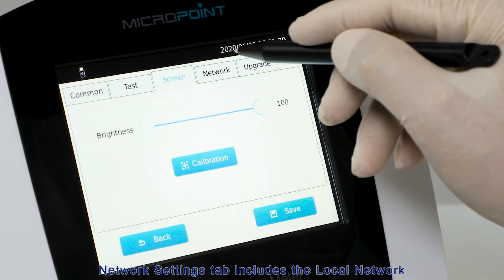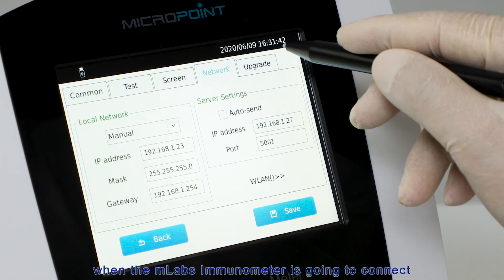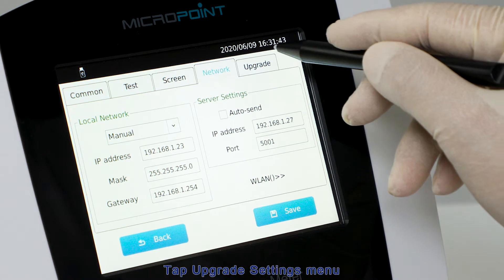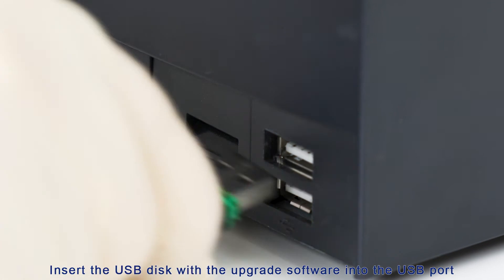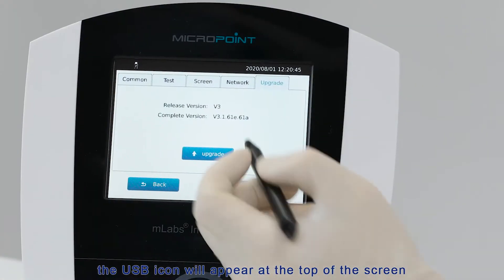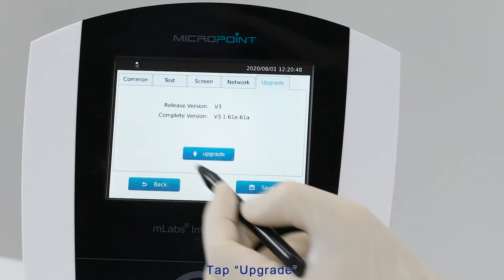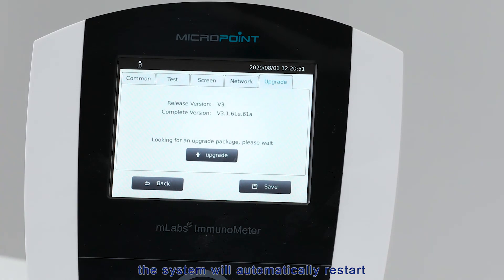The Network Settings tab includes local network and server settings. When the M-Labs Immunometer is going to connect with an information system such as a Laboratory Information System, please contact MicroPoint for more details. Tap Upgrade Settings when doing a software upgrade — insert the USB disk with the upgrade software into the USB port. The USB icon will appear at the top of the screen. Tap Upgrade; when the upgrade is completed, the system will automatically restart.